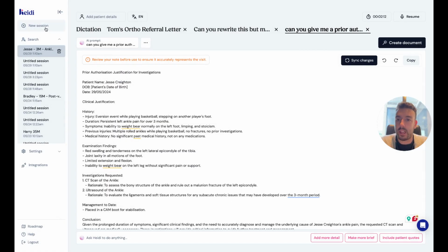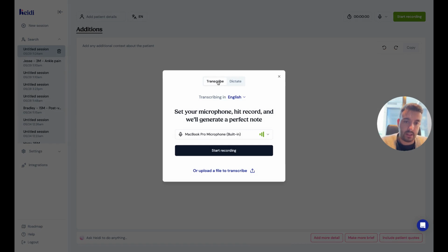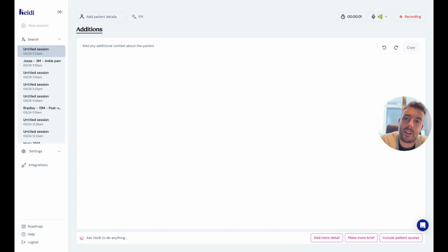So let's create a new session, more of our typical transcribe session, just to show you what's changed. So I'm going to do a quick back and forth between me and myself, a hypothetical patient. So, hi Tom, what brings you in today? I've had a cough for the last few days. Okay, tell me more about it. Just dry, sore throat. I've been traveling a lot. I've been in the US and the UK, visiting all our users of Heidi at Tool. Okay, and have you had any sneezing or any other symptoms of a cold? Yeah, I have been feeling a bit tired and a bit sneezy.